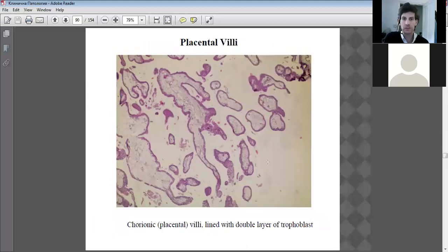The placental villi that are becoming highly vascularized. You can see a very good example of a capillary there, being sectioned, thin-walled, lovely normal border of the cells of the villi. Wonderful stromal cells there as well. Well, a very good slide. The placental villi are very well lined. No abnormal, no necrotic areas.